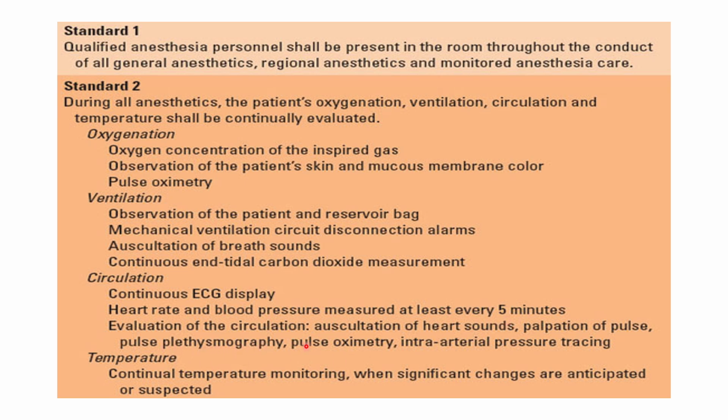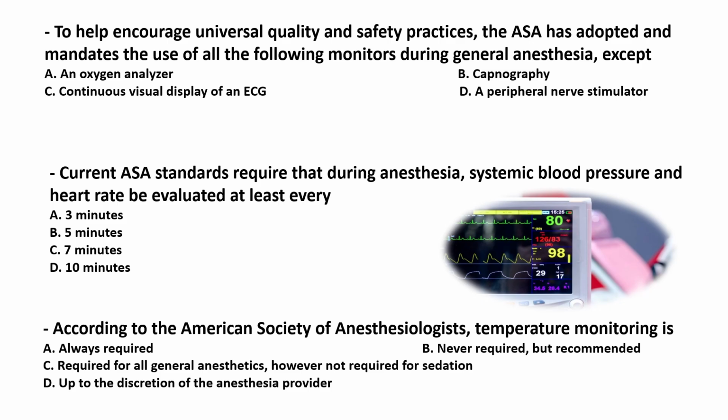Pulse plethysmography. This is the drawing of the pulse oximeter on the monitor. Pulse oximeter, intra-arterial pressure tracking, and temperature, as we said, when there is significant change anticipated, intended, or suspected. And here we have three MCQ questions, commonly coming in the exam.